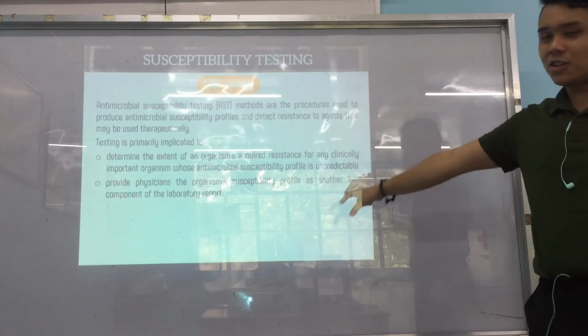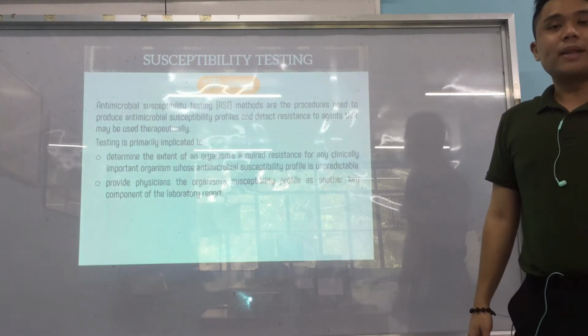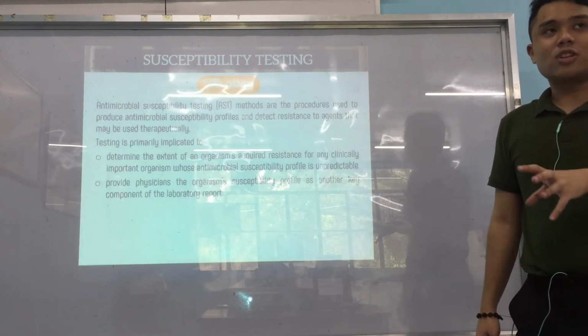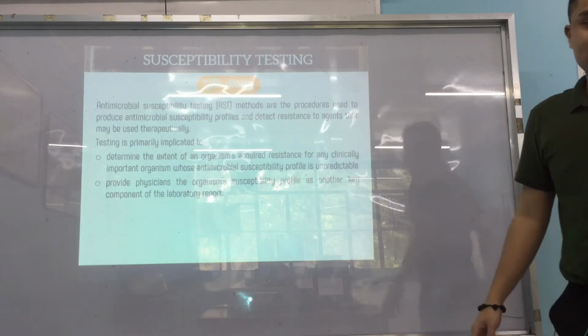And last is to provide the physicians the organism's susceptibility profile as another key component of the laboratory report. Ultimately, we want to provide the physicians pertinent information as to how we can treat the patient using these antimicrobial agents.